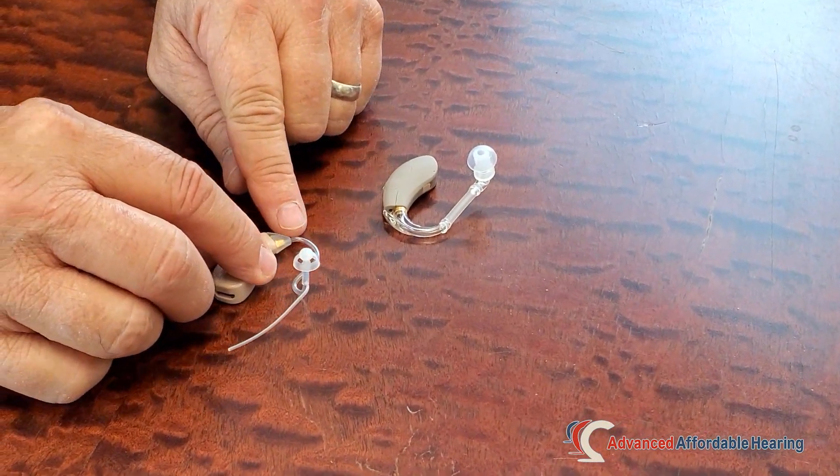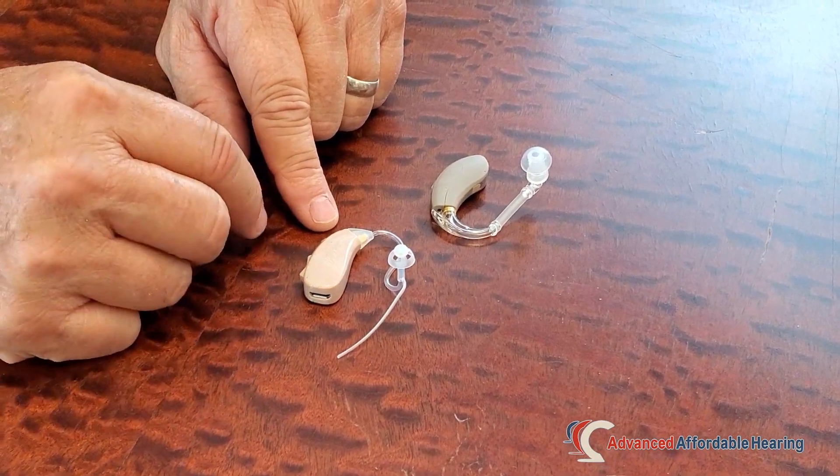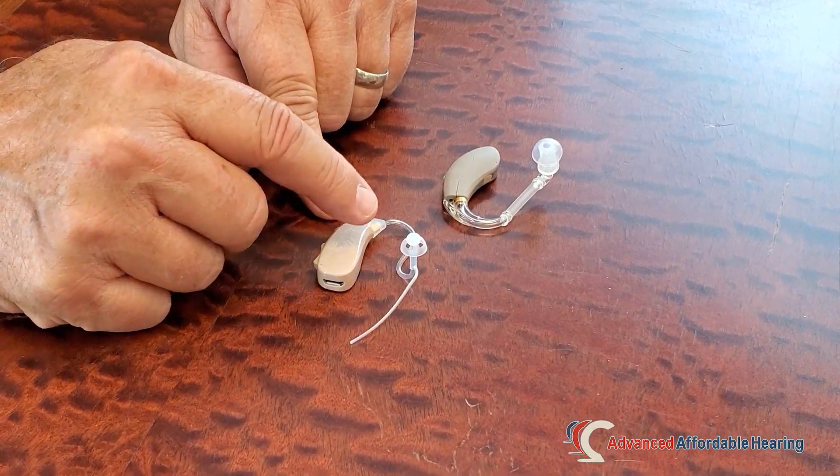The standard tube is what we call a thin tube, and it is exactly that — it's very thin, and it allows the high-pitched tones to be amplified and move through there just fine.